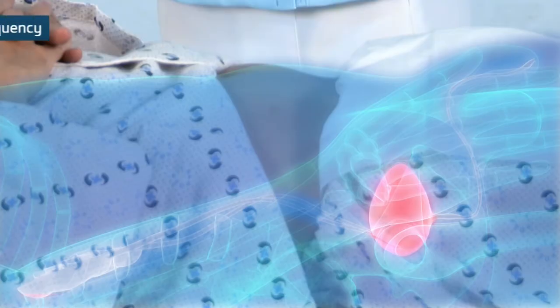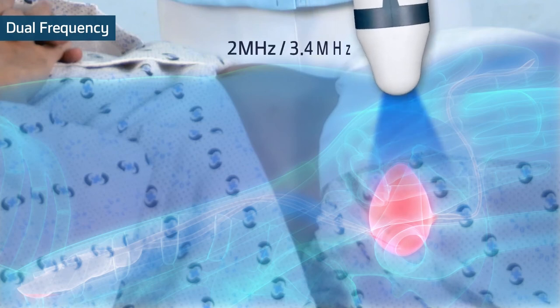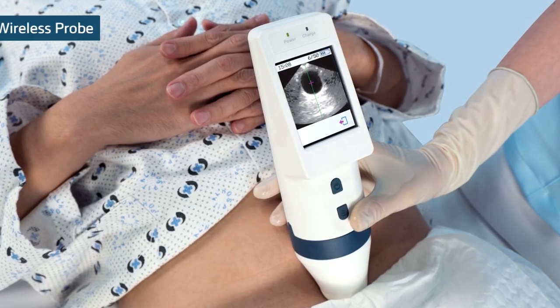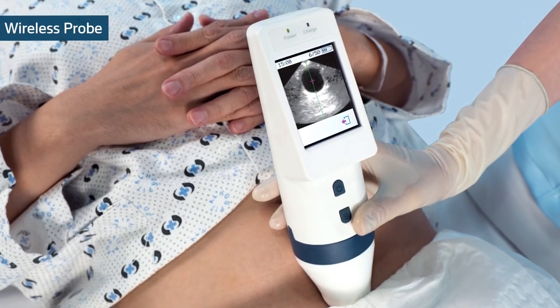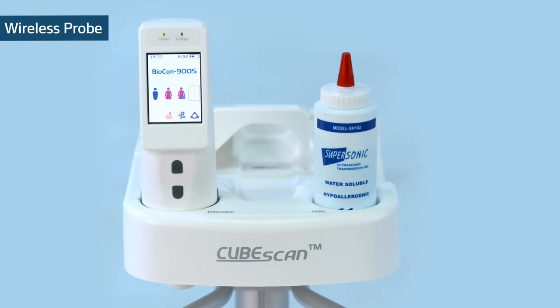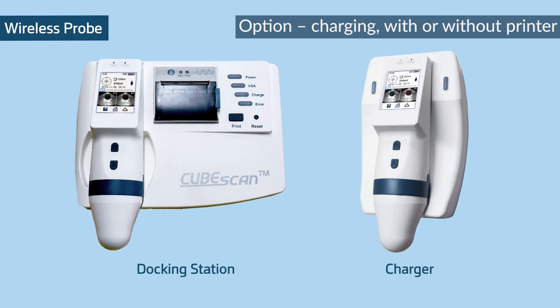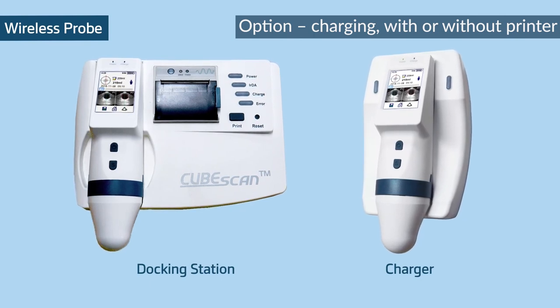Dual frequency: more accurate scanning is possible with CubeScan's dual frequency technology. Wireless probe: the handy-sized wireless probe surpasses space limitations. Furthermore, the option can be customized with charger and docking station depending on the facility environment.